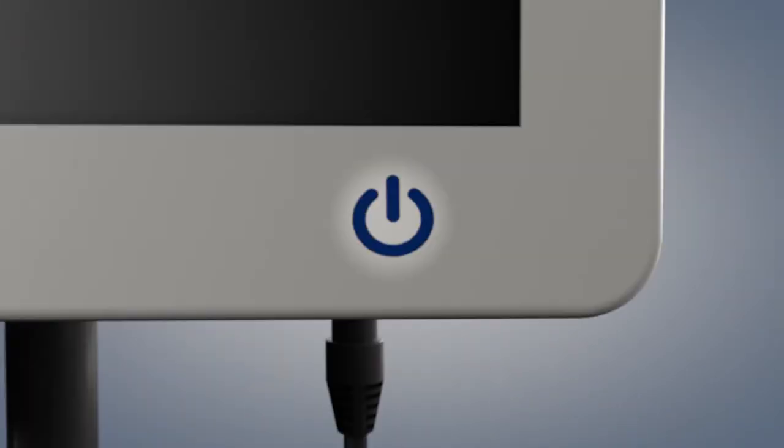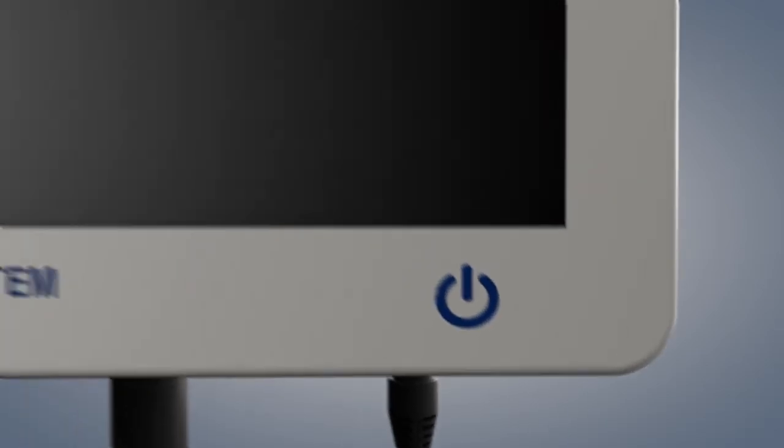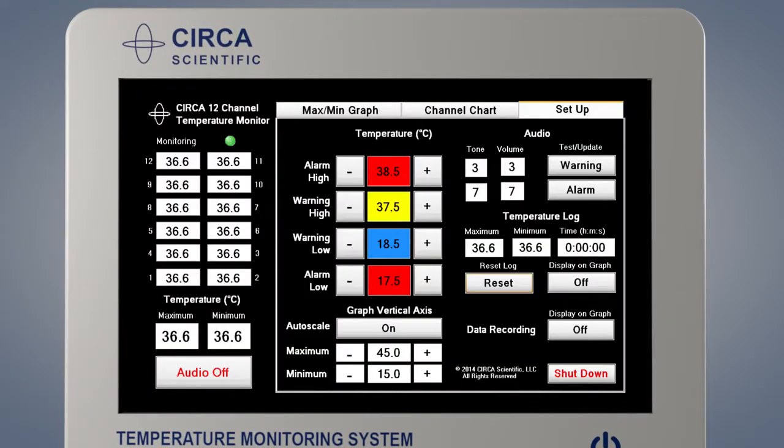Switch on the Circa monitor by pressing and holding the ON button on the front of the monitor until it glows blue. Release the button when the blue light appears. The program may take up to two minutes to start. When the monitor is first switched on, the setup screen will be displayed within two minutes.